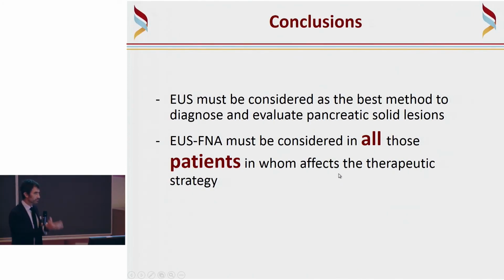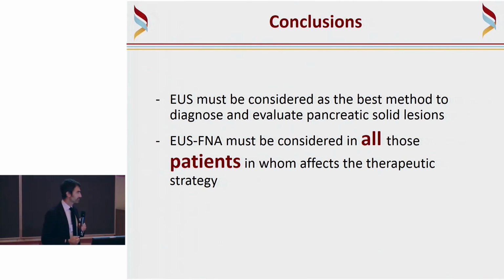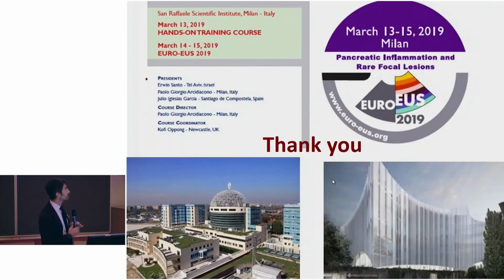So I have saved some minutes. We can now conclude that EUS must be considered the best method to diagnose and evaluate pancreatic solid masses. And nowadays, I think that EUS-FNA must be considered in all patients, particularly in those in whom it affects the therapeutic strategies. And I hope to see you in Milan in March.